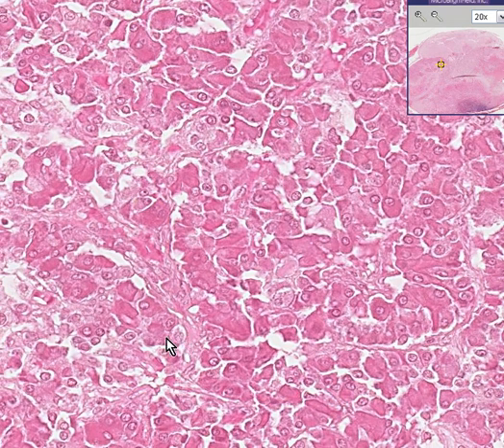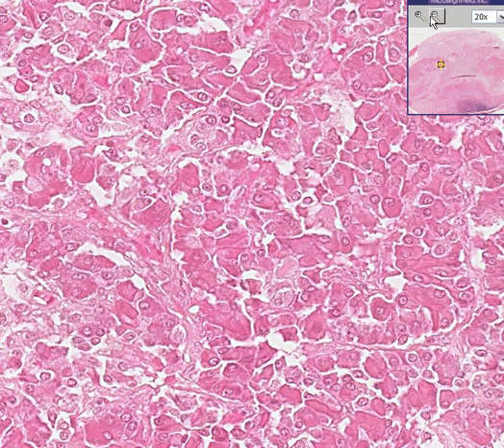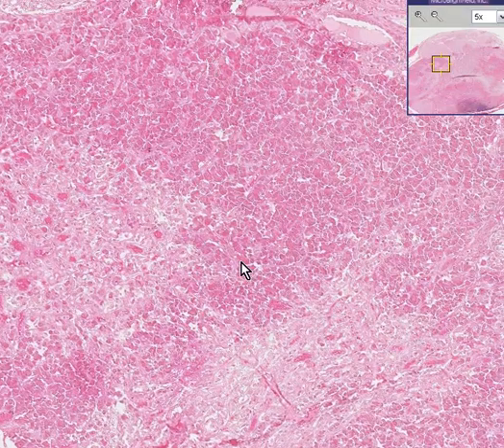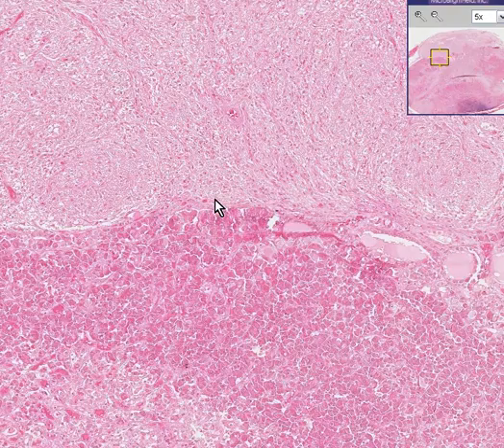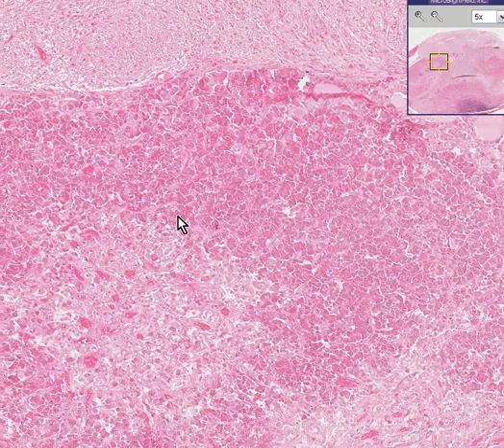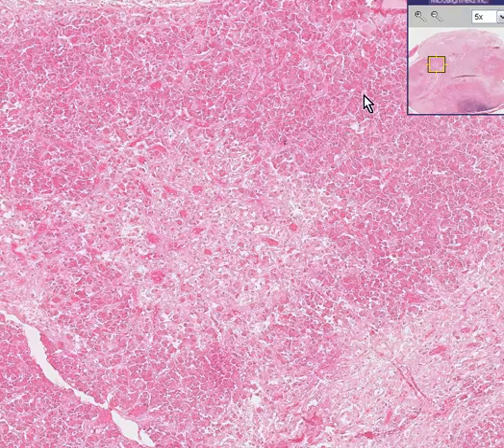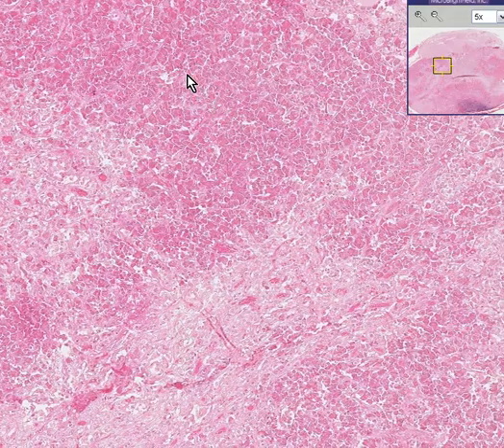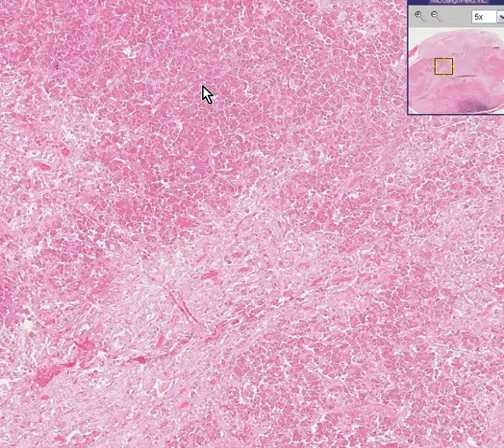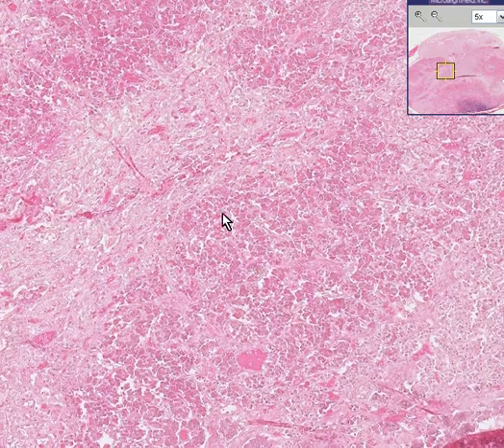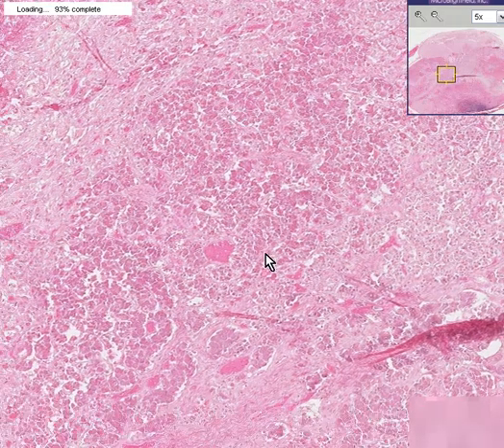Some cells have minimal cytoplasm. This is a pituitary gland. The upper part is the neurohypophysis — the posterior pituitary with neural-like tissue. The bottom part, which is about 80–90% of the organ, is the adenohypophysis, with basophils appearing blue, eosinophils appearing pink, and chromophobes appearing colorless — chrome-less, as if they hate color.